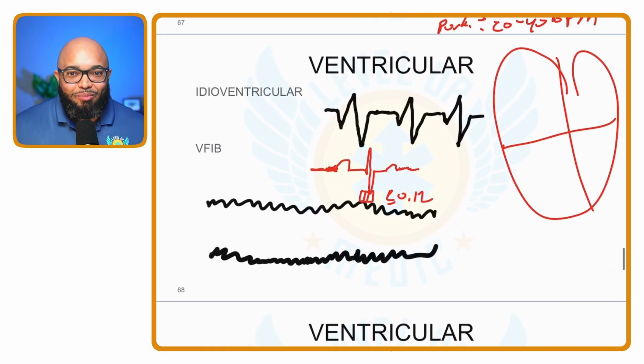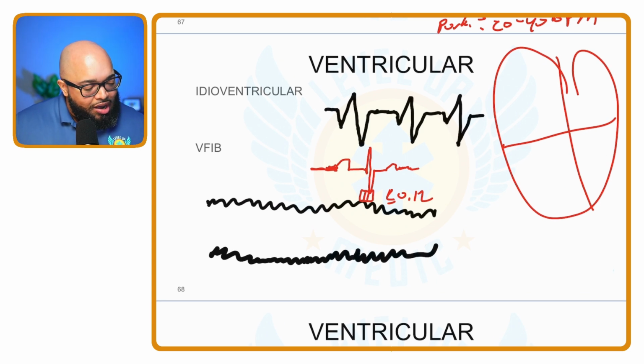We were on ventricular problems, okay? We talked about idioventricular, but just like with some of this other stuff, it depends on what else is going on. So if you have an idioventricular rhythm that's causing, let's see.